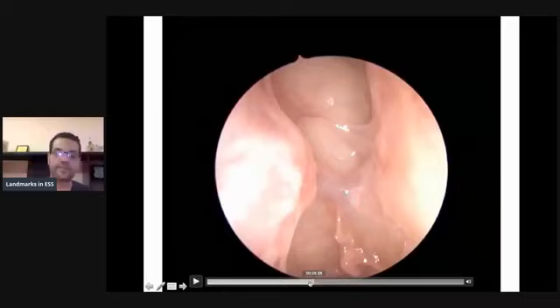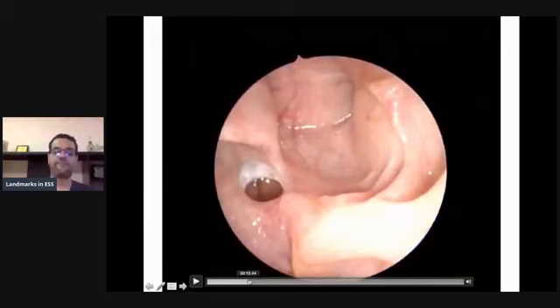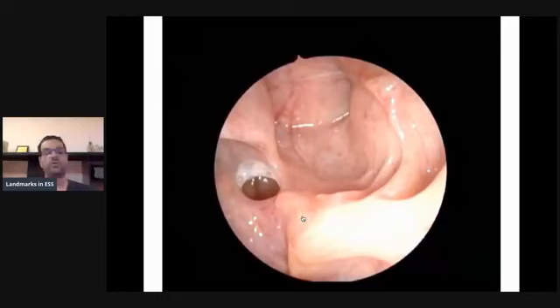I see this region. So this is our cell, right? So this is our cell that we described. I like to focus on this because remember, I'm showing you this retromaxillary cell, and this is the lamina papyracea right here. Remember, if I would have missed this cell, now let me show you what's going to happen. If I would have missed this cell, I would have a cell right here over the lamina. Which means that this area of the posterior ethmoid wouldn't be clear, and then you would have this area harboring disease that's going to form polyps, and the polyps are going to come over the sphenoid sinus ostium, and then you end up obstructing the posterior ethmoid, the sphenoid, the posterior sinus group with disease, and then the patient ends up with recurrent disease.